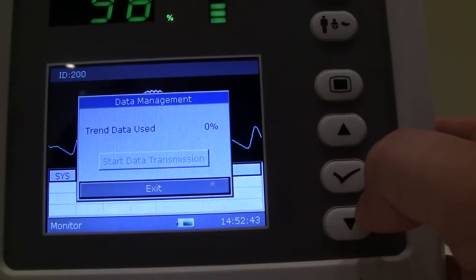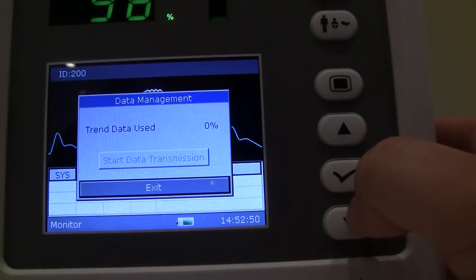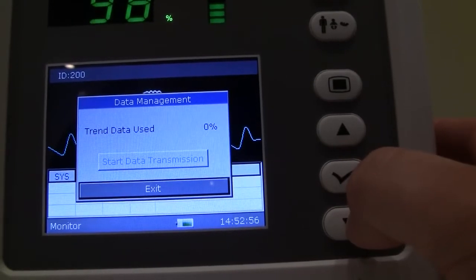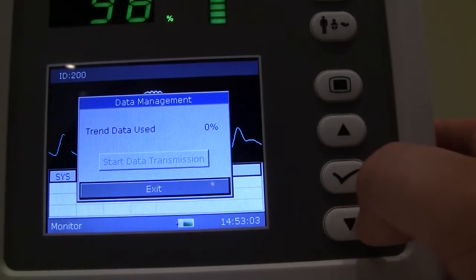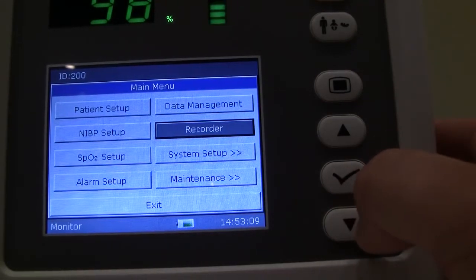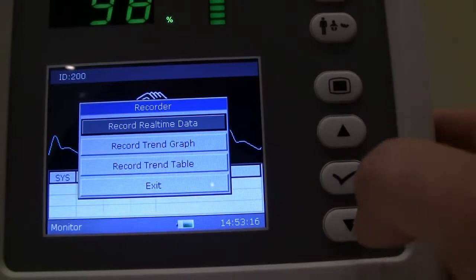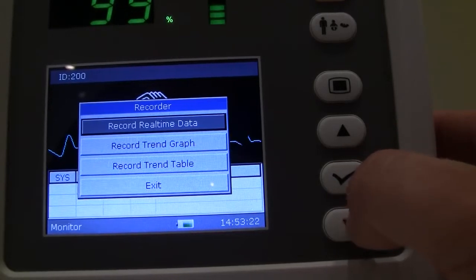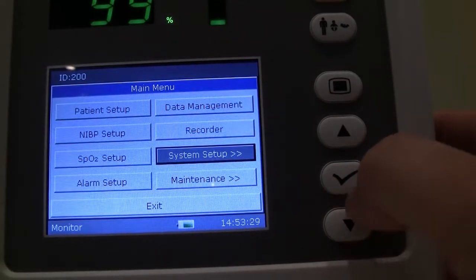Data management is an option. If you do have this unit configured, you can easily transmit the data to a personal computer where the vital signs history and trend data can be captured and stored, created into various types of format, including a PDF, and uploaded to the patient's electronic medical records if need be. These devices are HL7 based, which is nice, and we do have a central monitoring station that's currently pending FDA approval. Recorder, as I mentioned, this particular unit does not have an onboard thermal recorder, but if it did, this is where you want to set your recording options, where you're capturing real-time data or recording trend graph data or trend table data at increments that you so dictate.